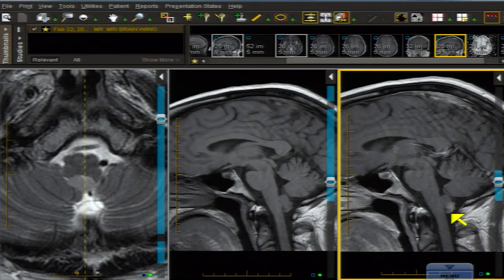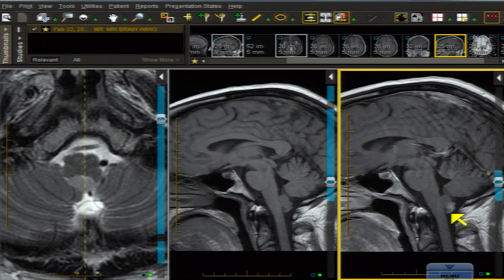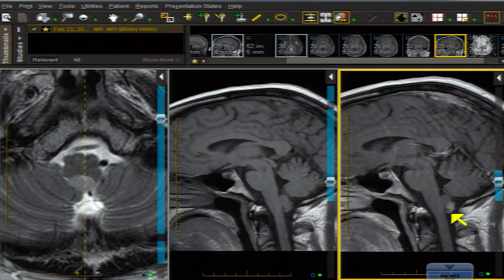Regarding the enhancement: if you read about subependymomas they're described as non-enhancing. This location — the fourth ventricle — is actually the most common location, and the second most common is the lateral ventricle. If they are going to enhance, the ones in the fourth ventricle location enhance more often than those in the lateral ventricle. So that's a useful additional pearl.